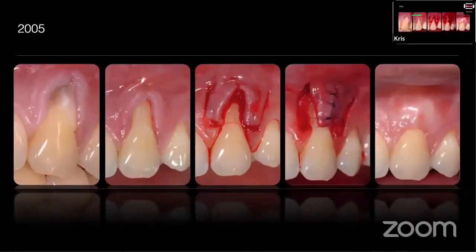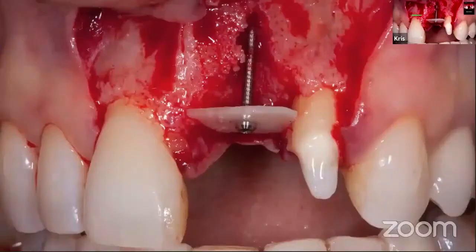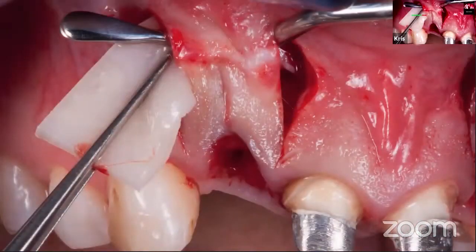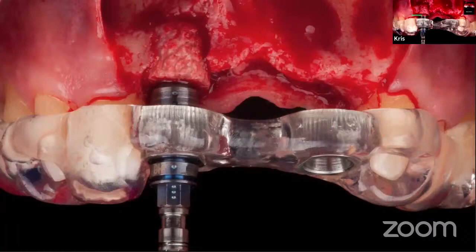Surgical documentation is the most challenging for the doctors, because we have not only the patient and the camera setup assistants, but also a situation where we cannot work with endless time. We have limited time for the surgery and anesthesia. So depending on the type of surgery, we are taking shots which will document the specific procedure, the specific protocols or tools which are used, everything just to show how this specific protocol was taken or given.